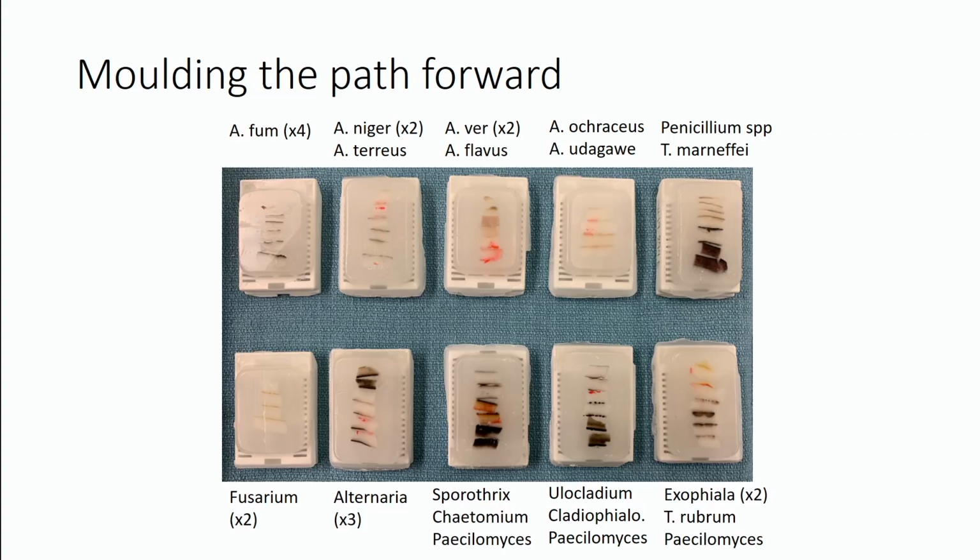And in all of these cases, the histopathology was positive. So I think there really is a niche for this assay. The way we've gone about trying to start this is by collaborating with my colleague Lori Barassa and the mycology staff to collect interesting, clinically relevant molds, cut them up, and embed them as formalin-fixed paraffin-embedded tissue.